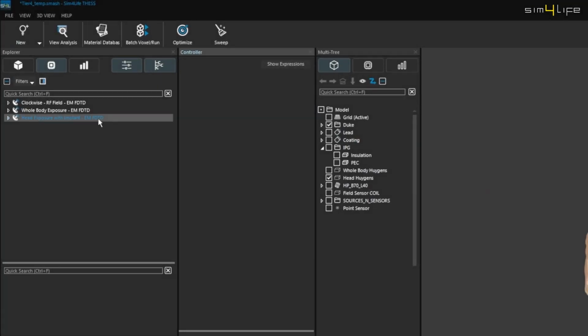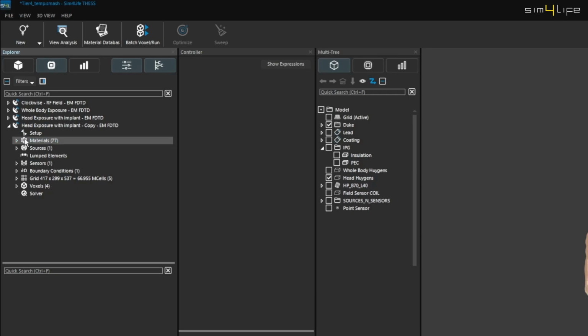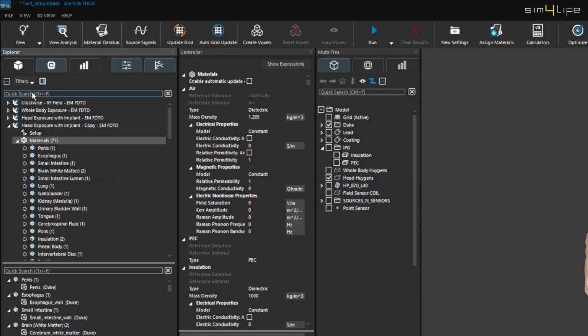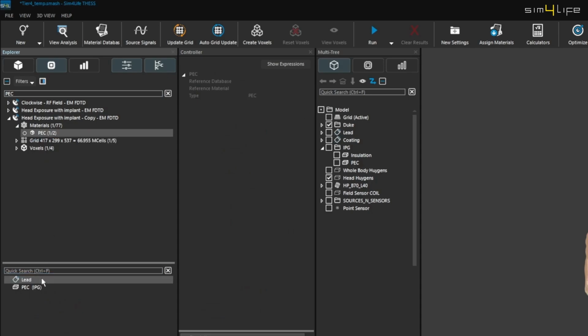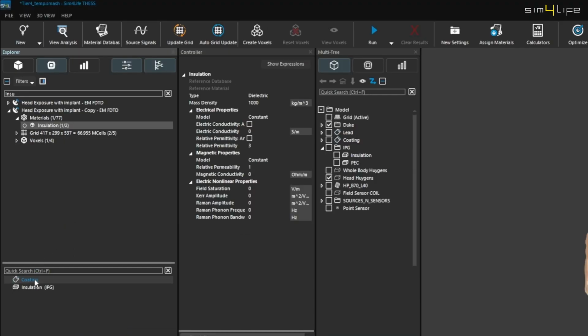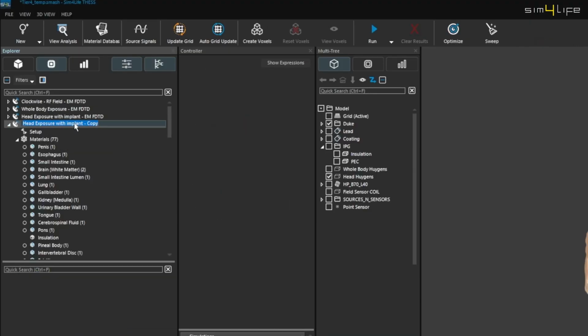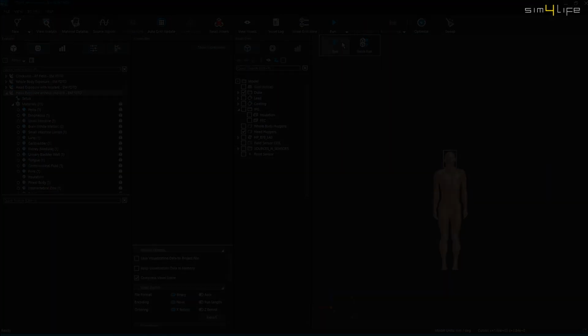To calculate the scattered field, we clone the previous simulation and remove all implant materials by deleting the PEC and insulation entities. This leaves Duke exposed to the MRI field without the implant. Important: do not update the grid after removing the implant. Once the simulations are complete, we'll move to the analysis tab to evaluate the results.